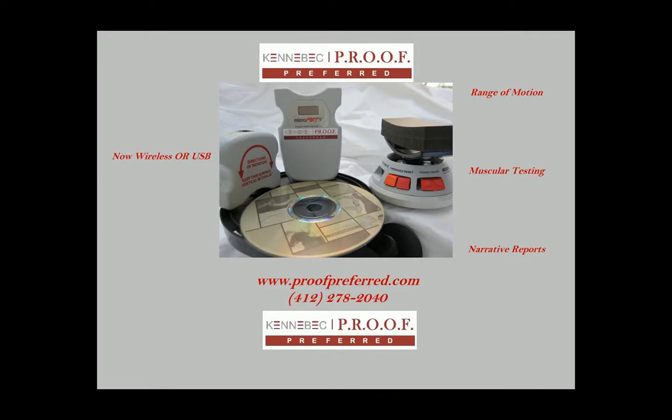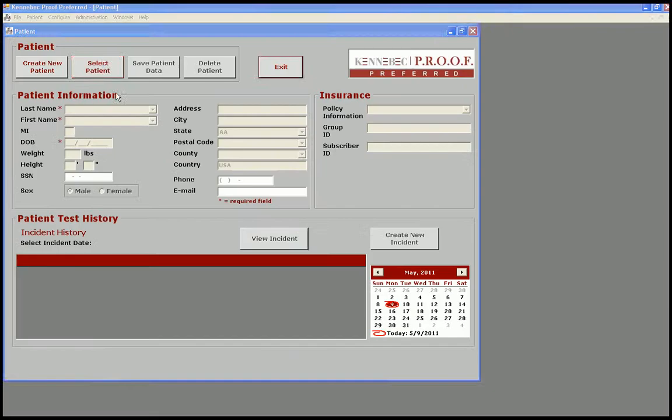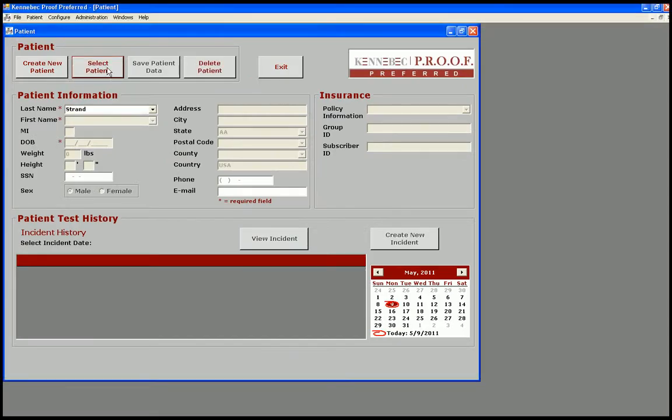Welcome to a short demo of our functional assessment system for easily testing your patient's range of motion. We have a very simple patient database.